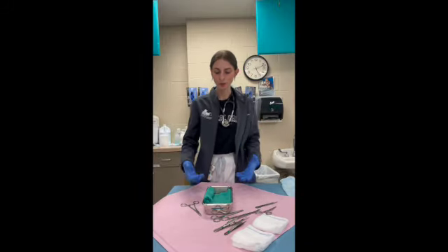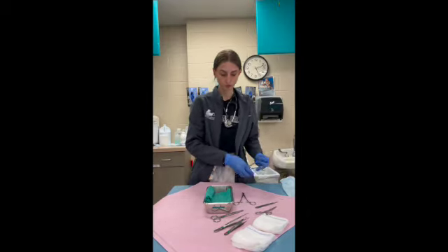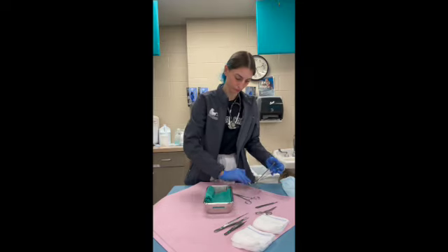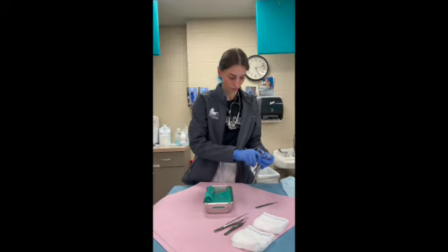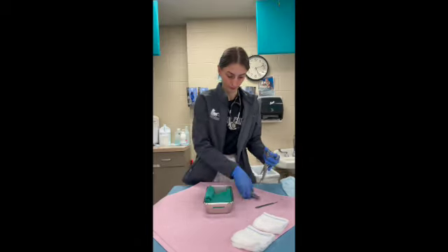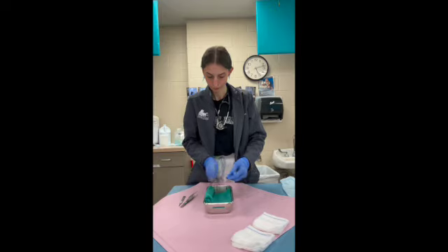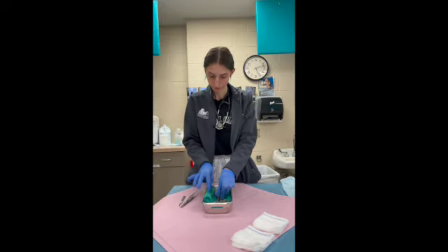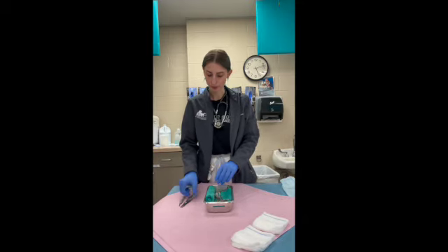Alrighty, and now we will let our instruments sit and dry, and then we will begin assembling our pack. Now that all of our instruments are dry, we're going to start assembling our small wound pack. I'm going to take my instruments, and I like to start from largest to smallest. I have a wound tray, and then a towel in here, and then my instruments on top.